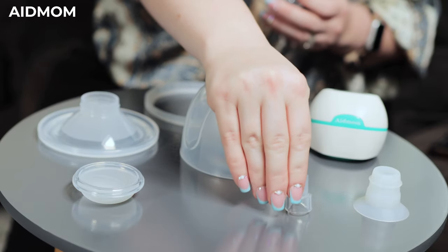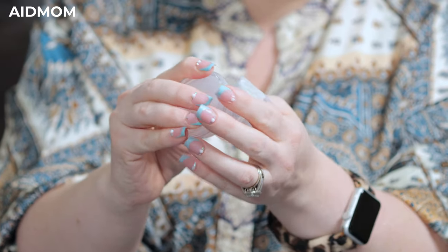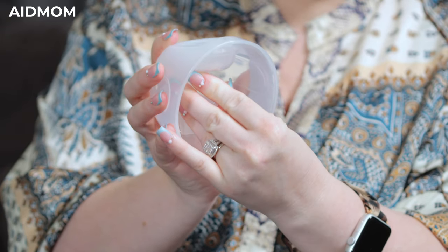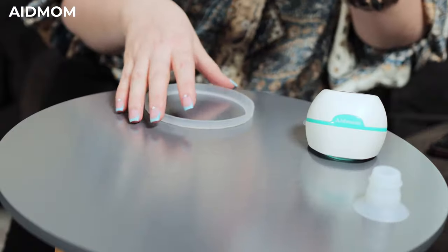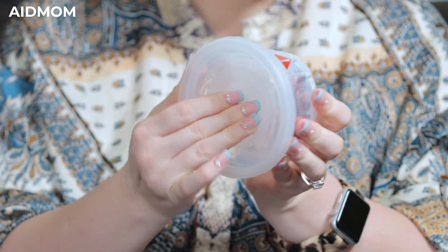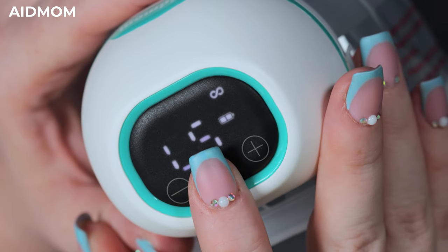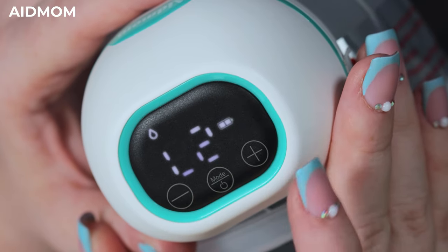8mom pumps are very easy to assemble. The HD touch display is easy to use. There are three modes that can be changed with the touch of a button — from massage to continuous pumping, or massage and continuous pumping simultaneously.